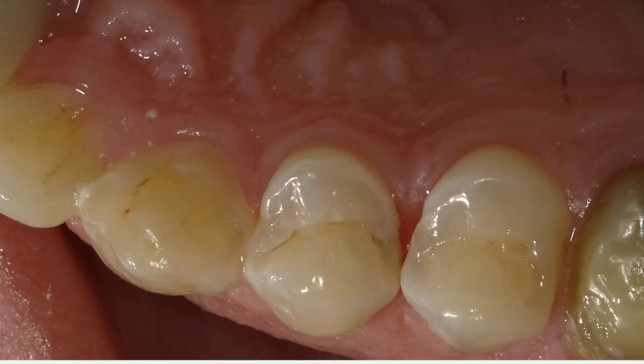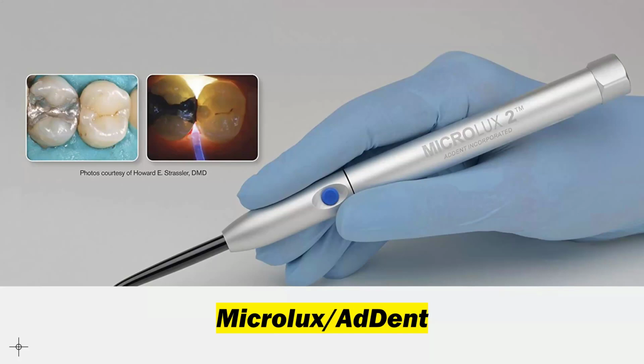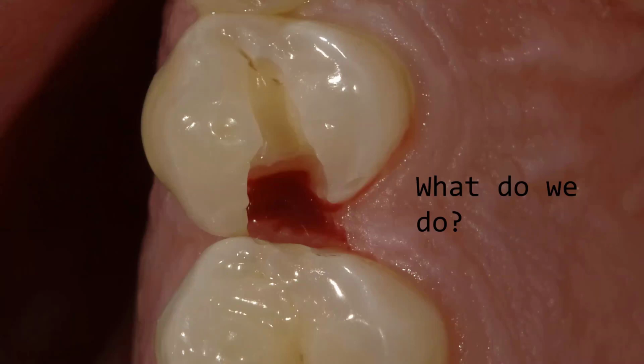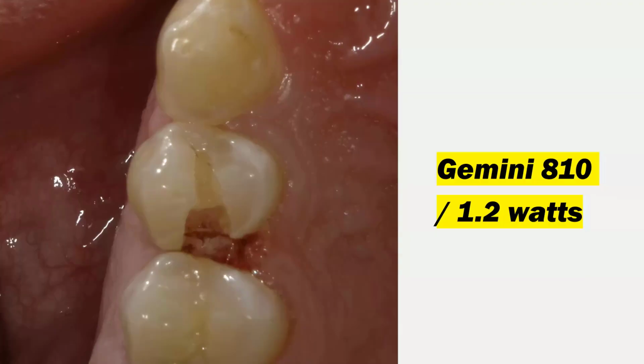So lasers and electrics kind of go hand in hand, especially in restorative dentistry. Here's a typical class two on the bicuspid. Digital x-rays fool us all the time. We see nothing there. But using our Microlux 2, a transilluminator from a company called Adent, one of the best $250 items you could have in the office, we're able to transilluminate in between the teeth, and we know we see decay there. As you can see, I open it up. But I also know that tissue is very high, and once I finish my proximal box, I'm going to have bleeding that will be hard to control. So it's important that I've told the patient prior that I might need to use a laser to clean things up, because I'm going to charge them a fee for that if I do. Here we've used the Gemini at 1 watt or 1.2 watts. We clean up and reduce that soft tissue so we can create a clean gingival margin for restoration.